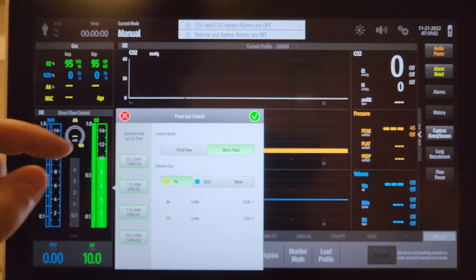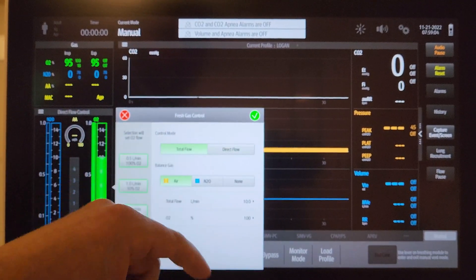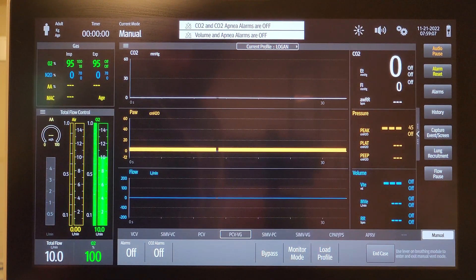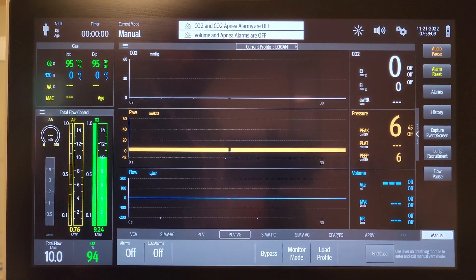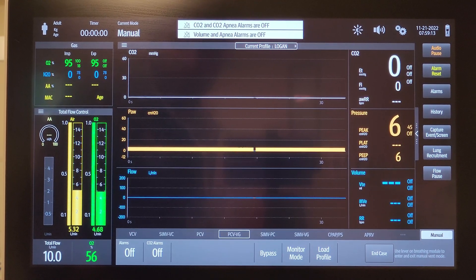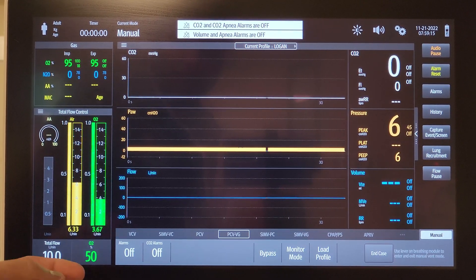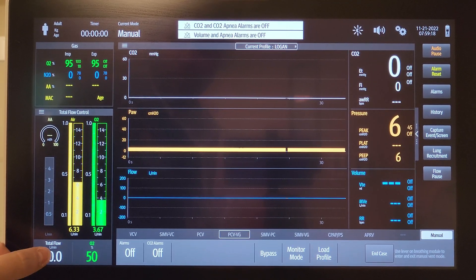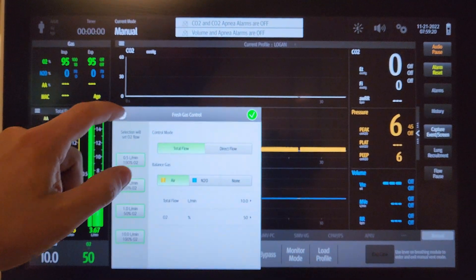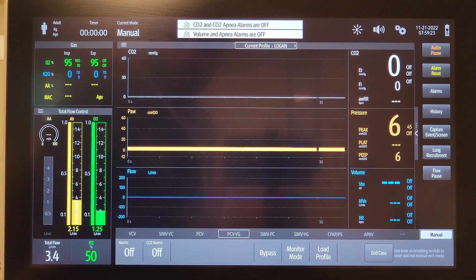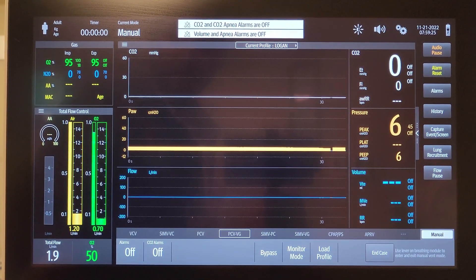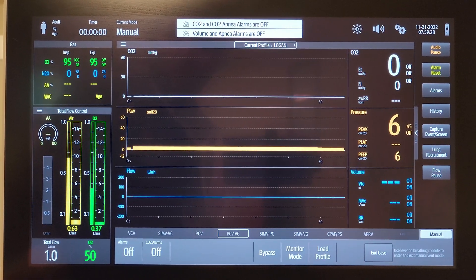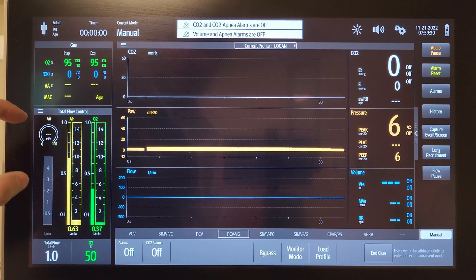There's another control mode that I particularly like called total flow. Total flow is where you adjust the FiO2 over here, so if I wanted a patient to run at 50% FiO2, I would dial that in. Then over here on the total flow, you can also just set your flows for the case just like this.